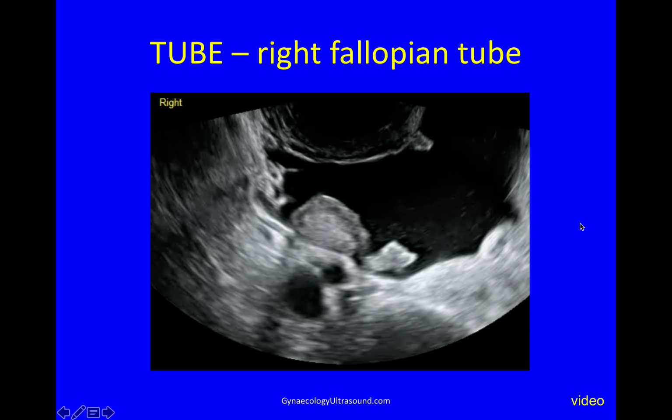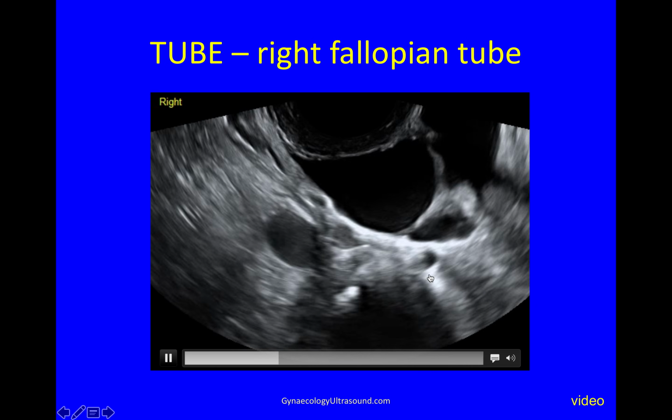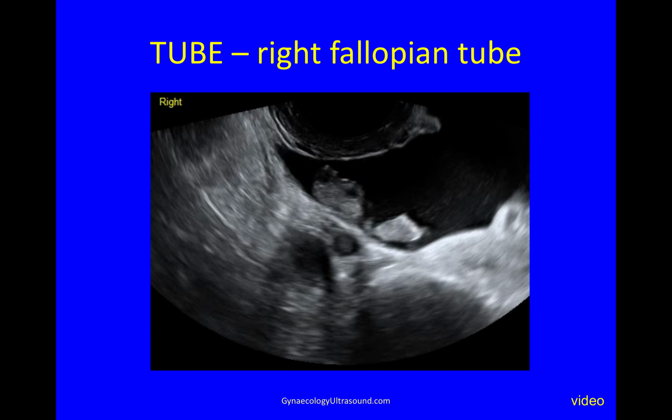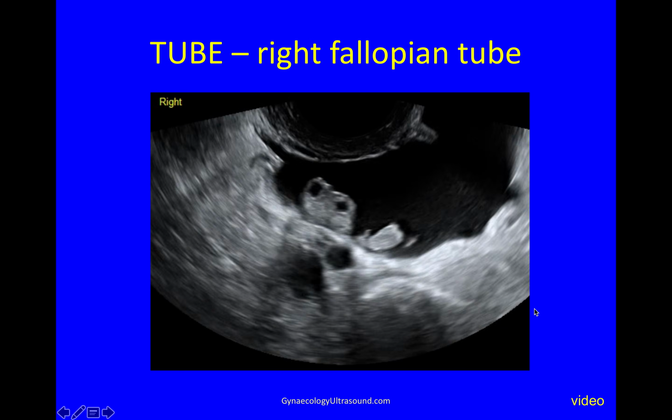And sometimes, particularly if there's fluid in the pelvis, something else pops up, and that's the fallopian tube. That's a normal looking fallopian tube, that's a bit of bowel, normal looking fallopian tube. So you can see these sometimes, but usually only the fimbrial end.